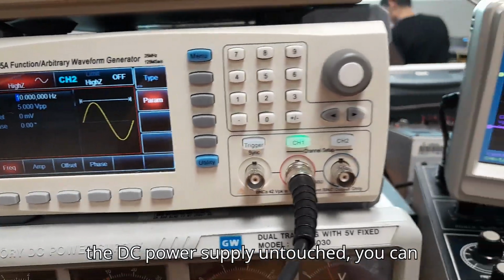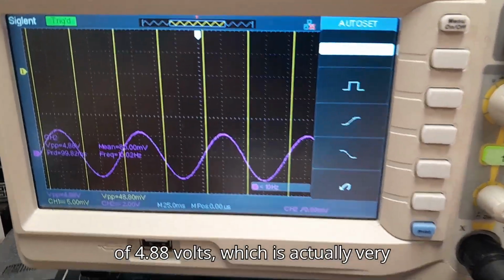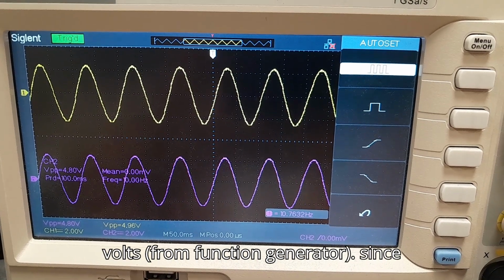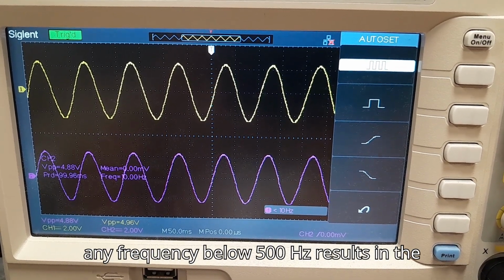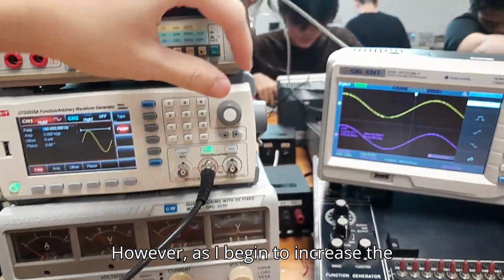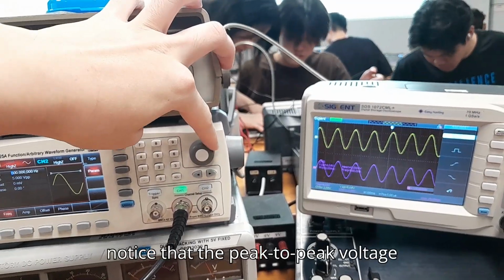you can see that the waveform has a peak-to-peak of 4.88 volts, which is actually very close to the 5 volts, since any frequency below 500 Hz results in the filter having unity gain. However, as I begin to increase the frequency, you will notice that the peak-to-peak voltage begins to drop.